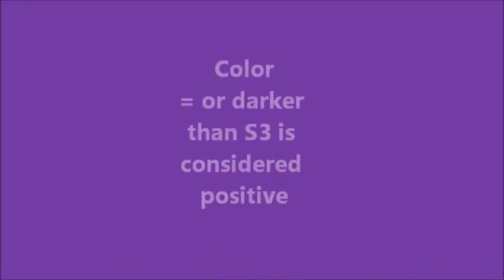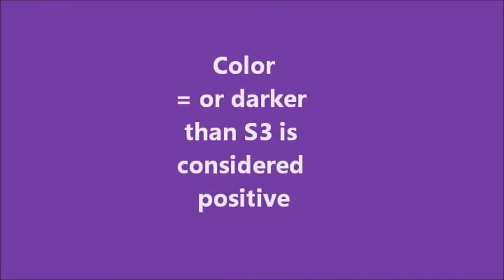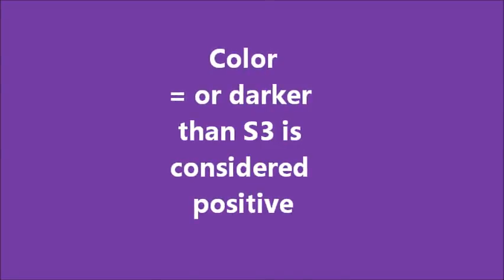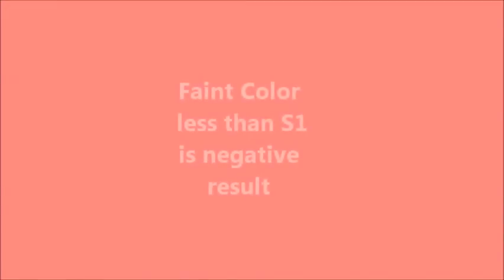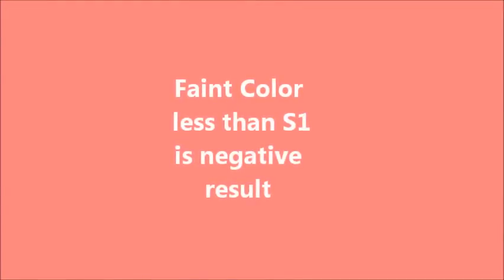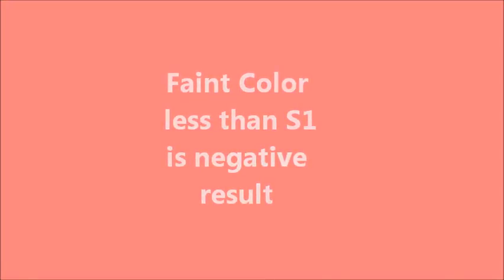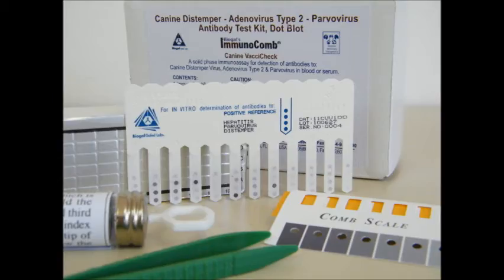A color tone that is equal or darker than the reference spot is considered a positive response. Repeat this step with every test spot separately. A faint color tone of S1 or less is considered a negative result. The results of the dry comb may be kept as a record as the color of the dots do not fade.